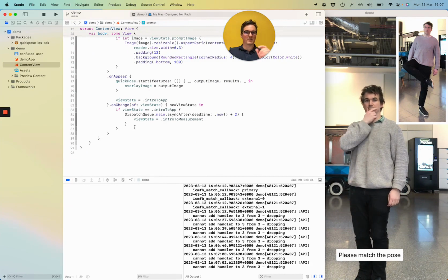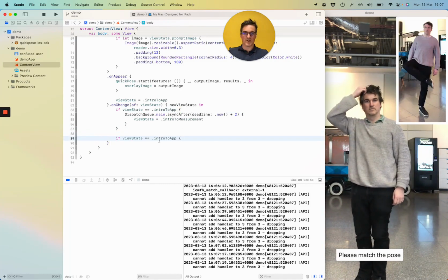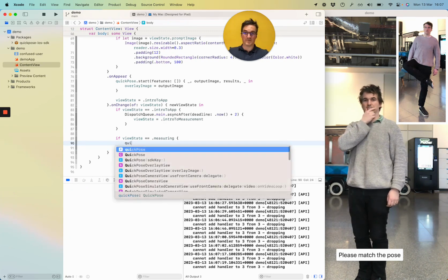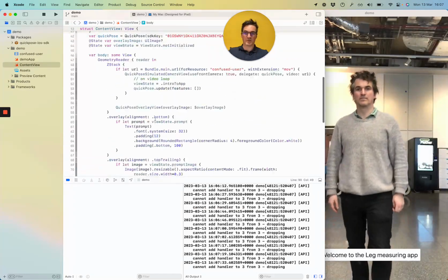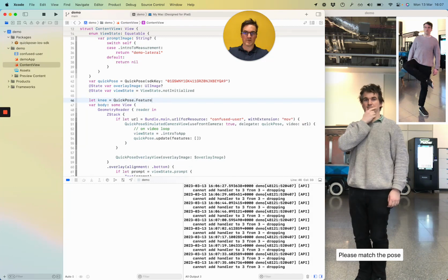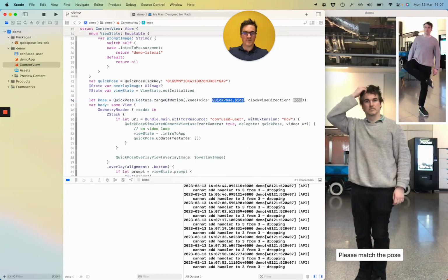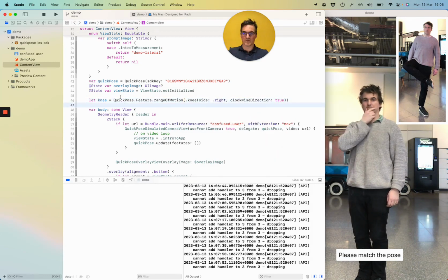We typically expect some sort of a feature to be applied and some sort of overlay to be shown on the screen. So we need to change what happens when we change the view state. When we change the view state to measuring, we want the features to be updated to a kind of leg measuring feature. I'm going to put this up here, and that will be clear why later. I'm going to call it a range of motion. Oh, it needs to know what type it is. QuickPose feature, range of motion, and I'm going to measure my knee, my right side, with a clockwise direction of true.